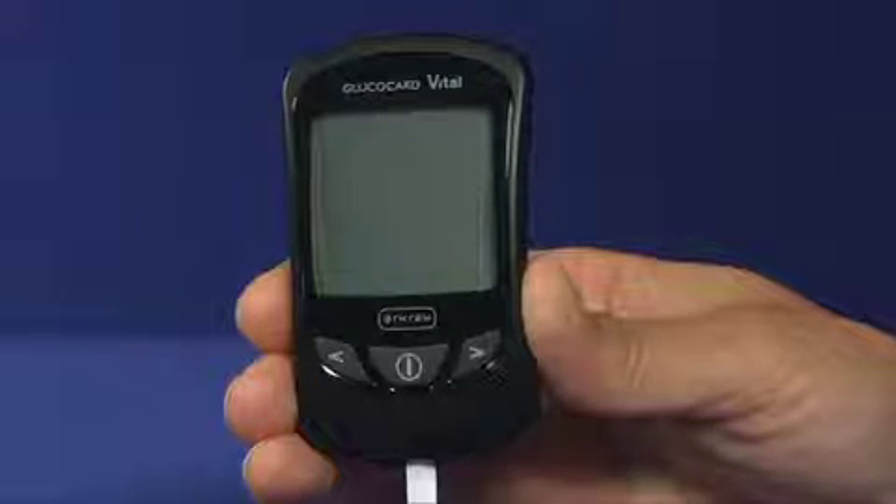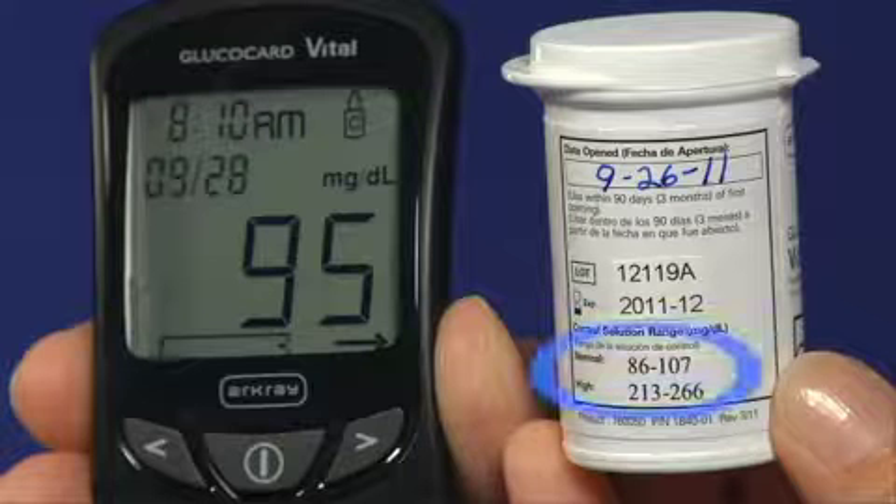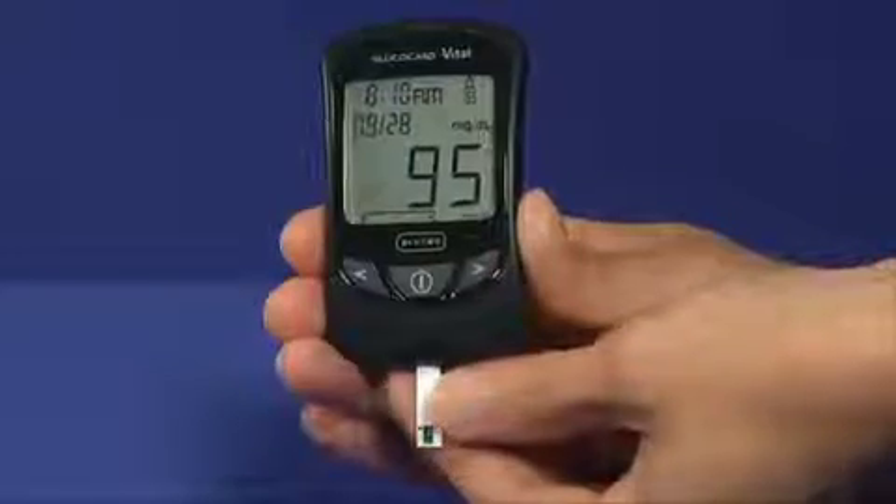Results will be displayed in 7 seconds. Compare the result on the display with the range printed on the test strip bottle. Make sure that you check the correct range for the level of control solution you are using. If results are outside of the range, check the troubleshooting guide in the user manual. Remove the test strip and dispose.